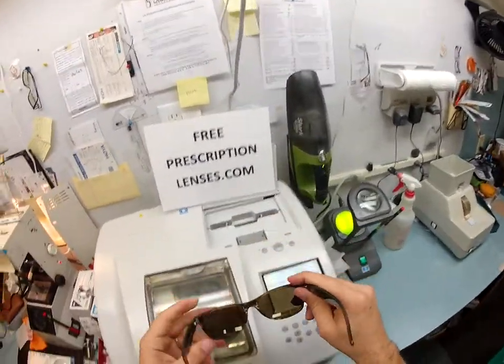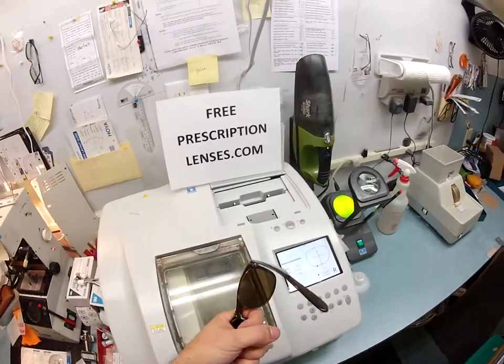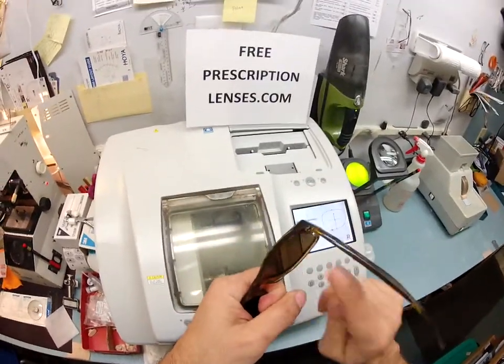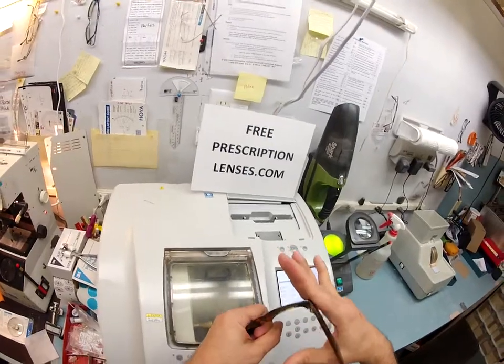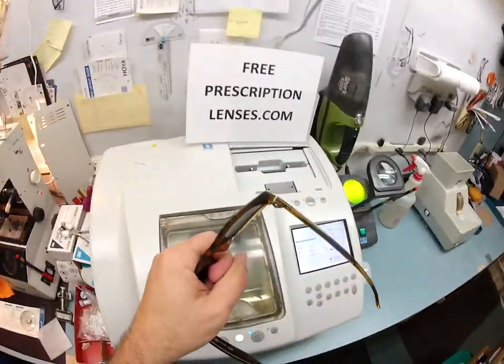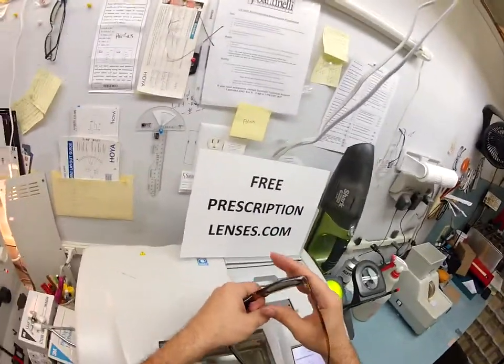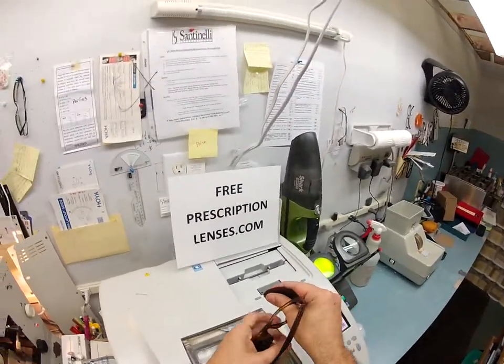So to take them out, I turn the frame downward. I'm right-handed, so I grab the frame with my left hand, and you can torque the frame. You're not going to hurt the frame, and you're not going to hurt the unbreakable lenses. But with the thumb, you push down at the nose, and with my fingers here, I kind of pull back on the frame. And I can pull really hard if I want to, because this is your frame. I'm not afraid of breaking it. I don't want to do that on my frame. But no, okay, so I pull backward, and with my thumb, I push down, or outward, out pops the lens.